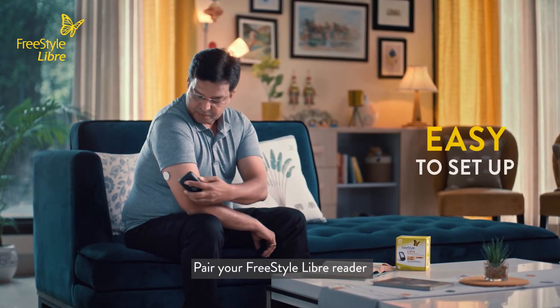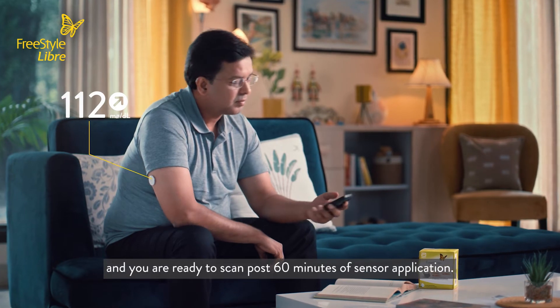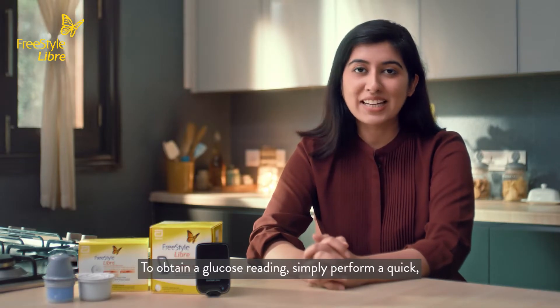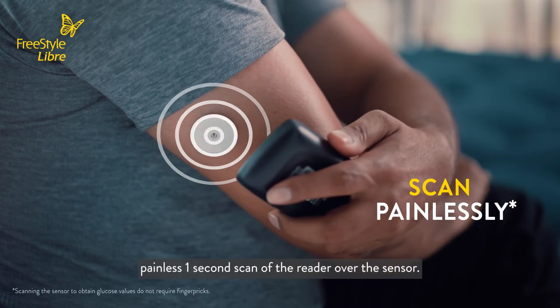Pair your Freestyle Libre reader and you are ready to scan post 60 minutes of sensor application. To obtain a glucose reading, simply perform a quick, painless 1-second scan of the reader over the sensor.